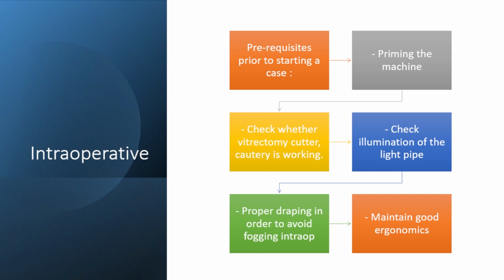What we do is, initially when you bring the lens in, it almost always gets fogged. Okay, but you take it a little away from the cornea, it gets defogged. Then gradually bring it down. The lens also learns. It's not an active learning, it's just a question of adapting to the fog. After all, if you take an indirect 20 diopter lens from the general ward to one of the rooms on the sides, 31, 32, etc., the minute you open the box, it gets fogged because it's been in a cold environment and you bring it to a warm environment. But you leave it for some time, it gets defogged.